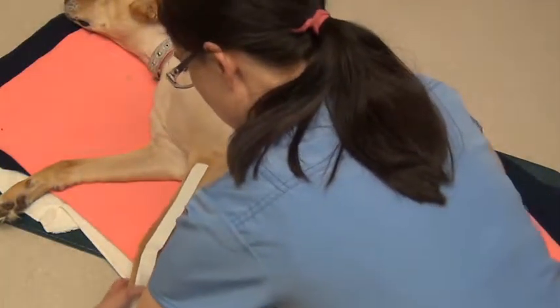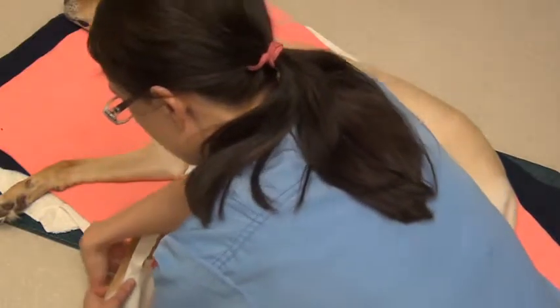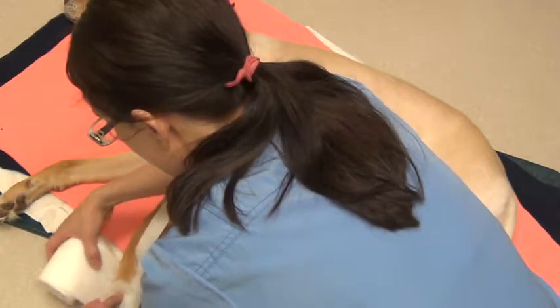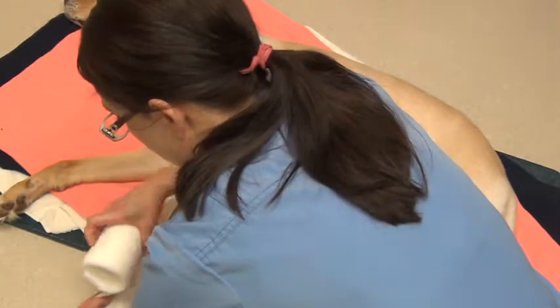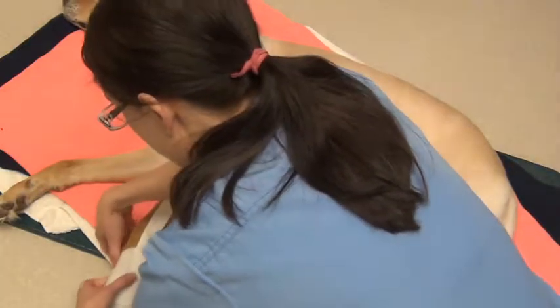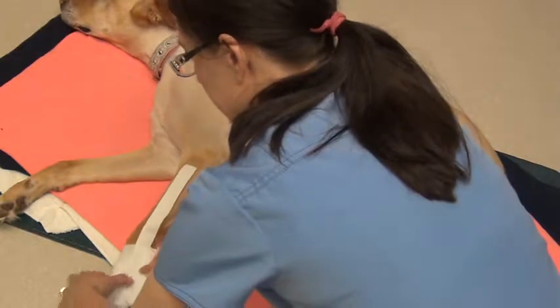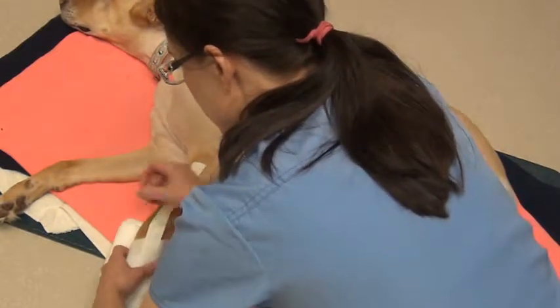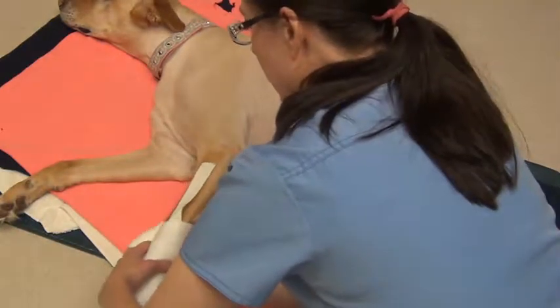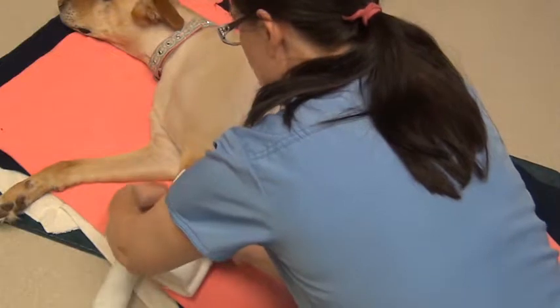So I'm going to go ahead and start with the roll gauze. Excuse me, the cast padding. And when I start, make sure my toes are sticking out. I want to make sure that when my spiral goes on, my next spiral is going to come over 50% onto the last spiral. And we are okay with the tightness on this. As Dr. Jody said when I watched her instructional video, it is virtually impossible to make this portion of your bandage too tight.